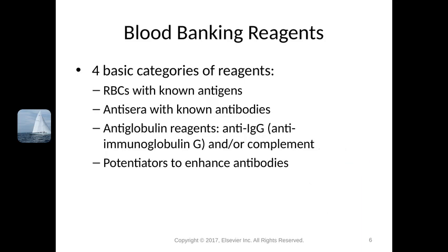they have their zeta potential in here. It's very hard for them to get close together. They're not designed to get close together. So what we need to do is minimize this gap here. So when we add our potentiator, all right, we get our red cells a little closer together.